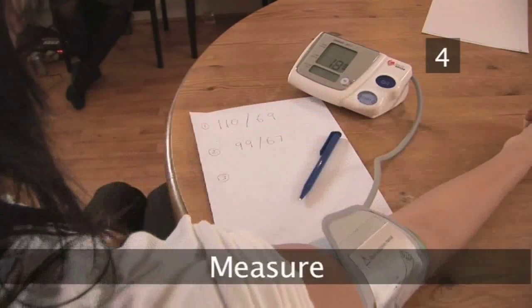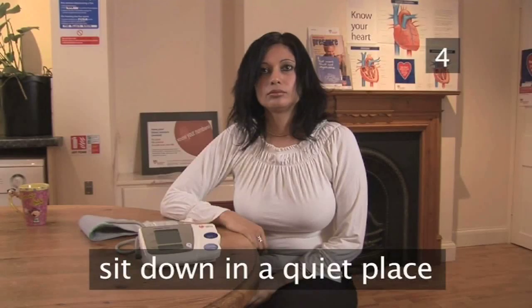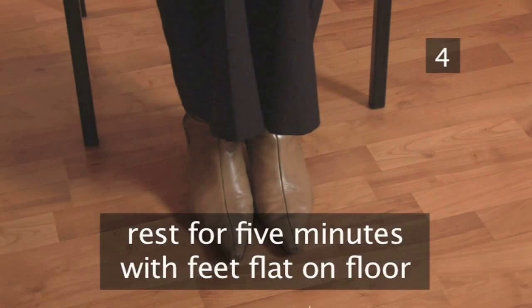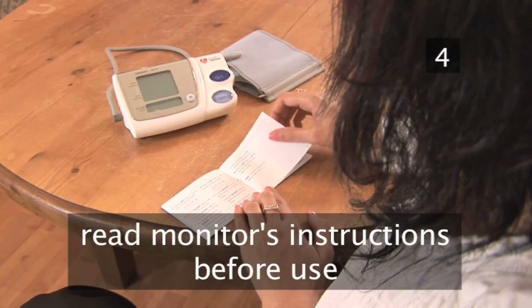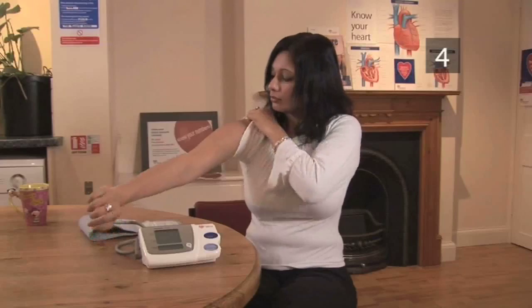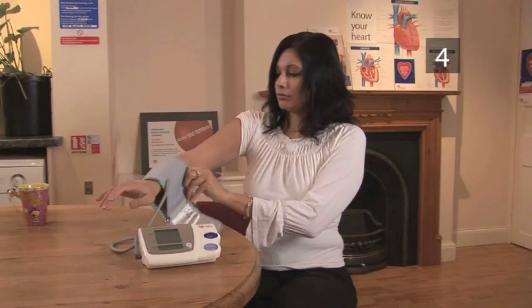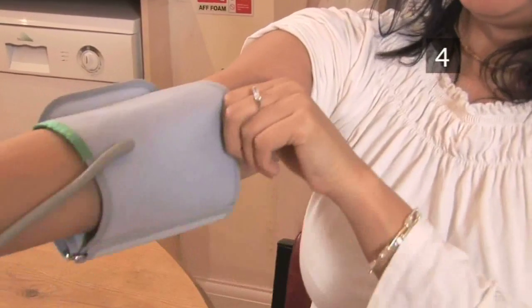Step 4: Measure. Sit down, preferably at a desk or table, in a quiet place. Rest for about 5 minutes. Your feet should be flat on the floor. Read your monitor's instructions before use. Fasten the cuff around your arm. It's important to use the right sized cuff, otherwise you may get inaccurate readings.